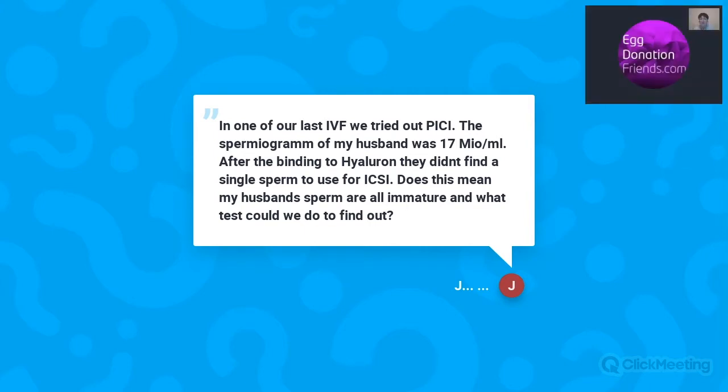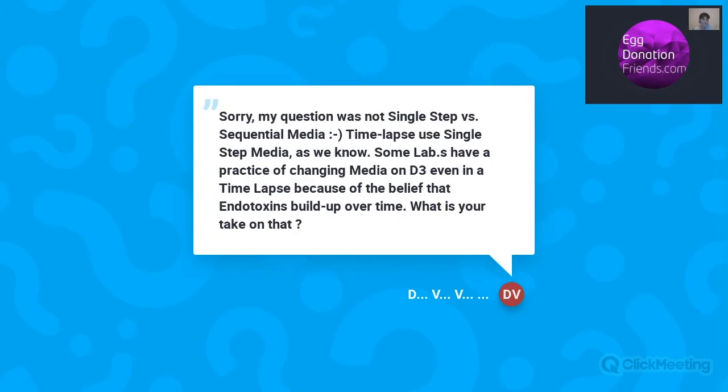And we have also the following up question to the one which we have. So if you have any additional comments on that. Sorry, my question was not single step versus sequential media. Time-lapse uses single step media, as we know. Some labs have a practice of changing media on day three, even in a time-lapse, because of the belief that endotoxins build up over time. What is your take on that?